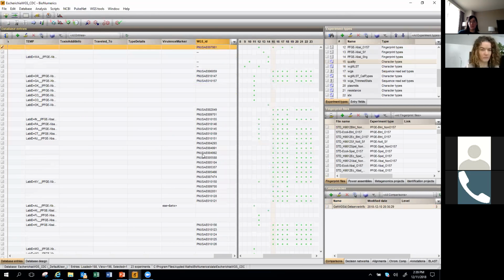I know some people have developed workflows that now utilize the WGS ID in different ways, and were a little bit unsure of how they felt about it now coming in at the end of the process. So you can get it at the beginning if that's something you need to do.